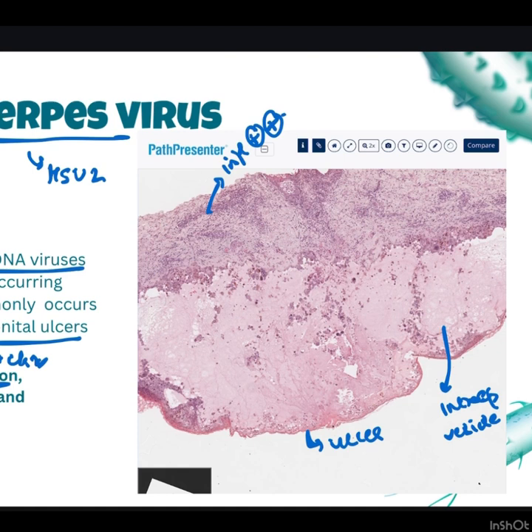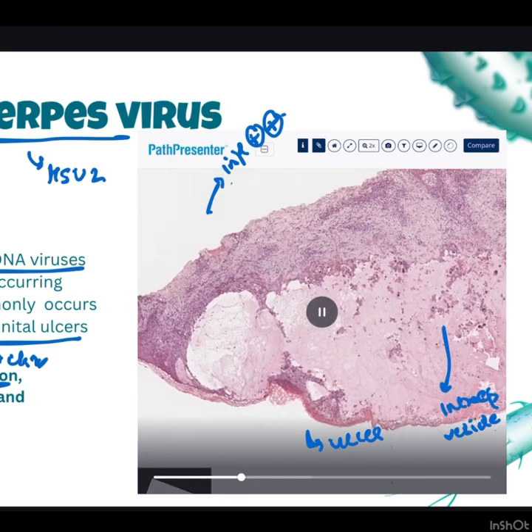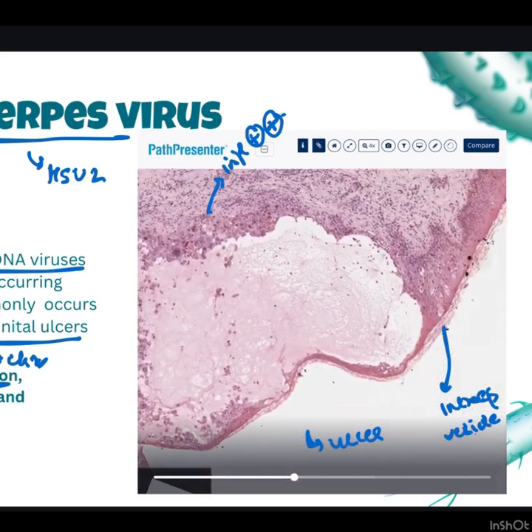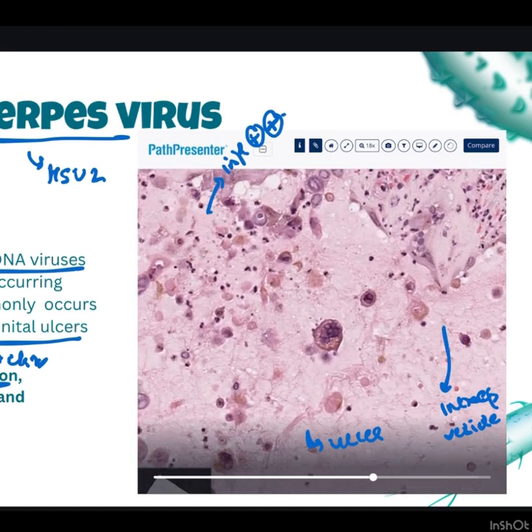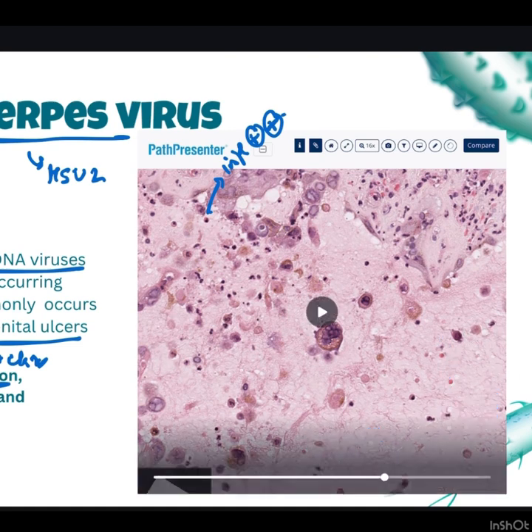Now, in these intraepidermal vesicular areas, as we go into higher power, we can see some cells which are not looking like any inflammatory cell. They look completely different from the typical inflammatory cells or any epidermal cells. They do not resemble anything. Let us go into higher power. Here you can clearly see these cells have a beautiful multinucleated appearance. This is what we call multinucleated cells.